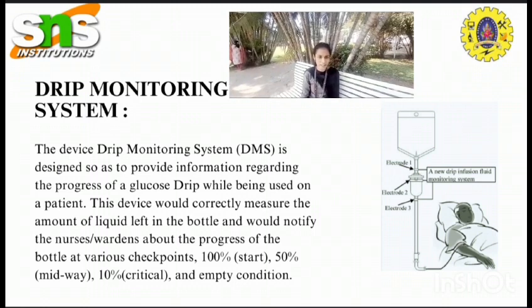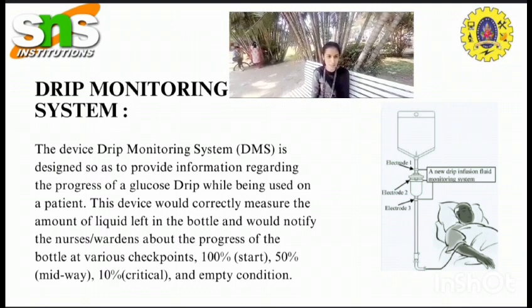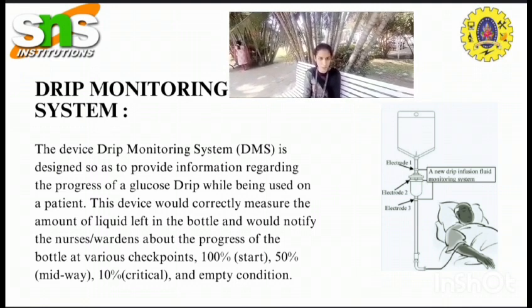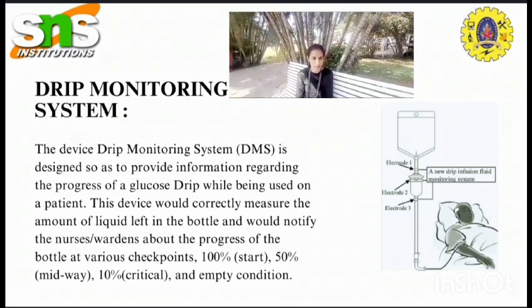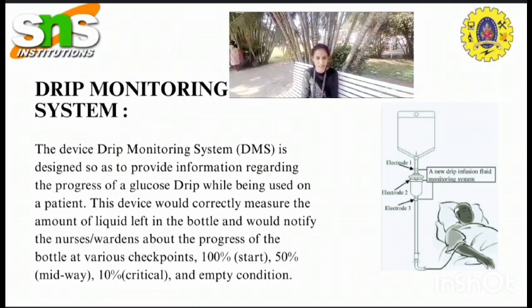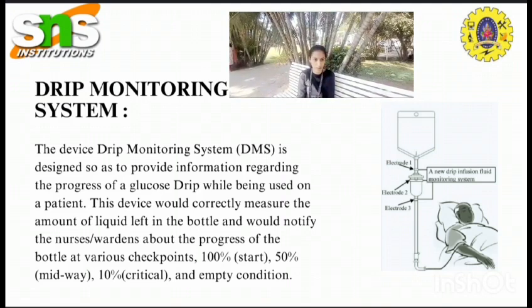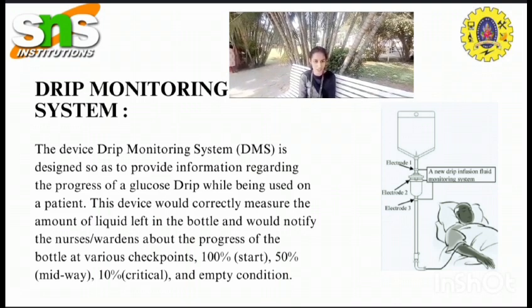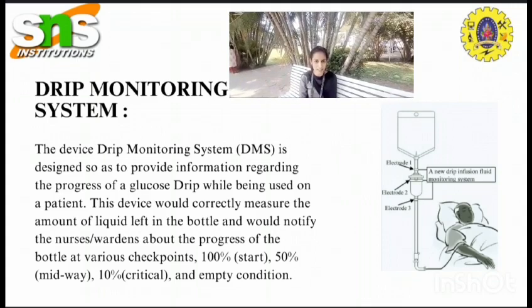In our current medical system, the monitoring of patients in a hospital throughout the day is a tiresome process. Sometimes doctors or nurses are too busy, so they cannot monitor each patient. This causes many problems. The hospital is injecting saline or intravenous fluids into the vein of the patient. If the drip system is not monitored on time, it will cause problems like backflow of fluid, blood loss, etc. In order to reduce the workload and overcome such critical situations in intravenous drip monitoring, we propose a drip monitoring system.